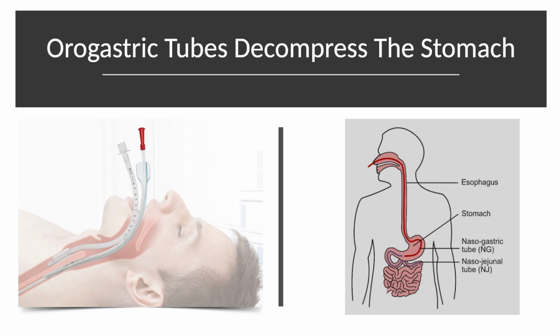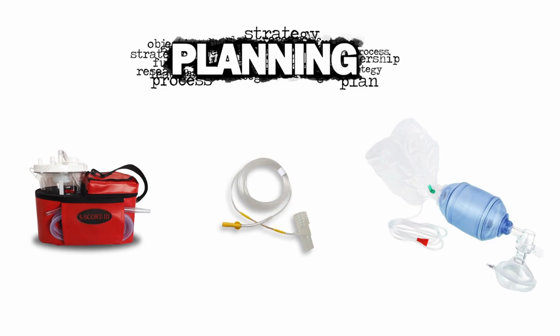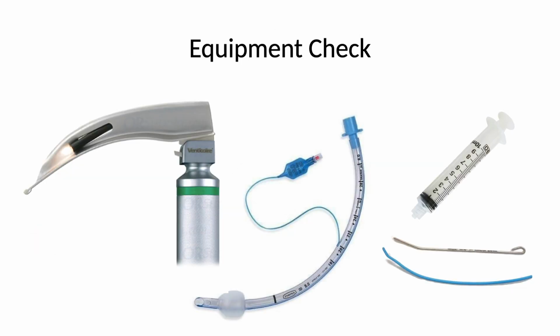If for whatever reason you've decided it's time to move on to intubation, you want to make sure, once you've made that decision, that you're going to actually intubate this patient with direct laryngoscopy. Equipment check is going to be key. So while you're setting yourself up and checking everything, make sure you have someone who is bagging adequately and very well. You always want to have suction ready to go. And then end tidal is an absolute must. So as soon as that tube goes through the cords, the next move should be hooking up the end tidal and making sure everything is working.